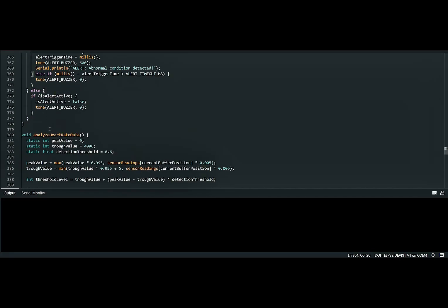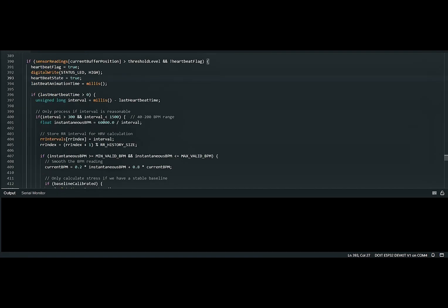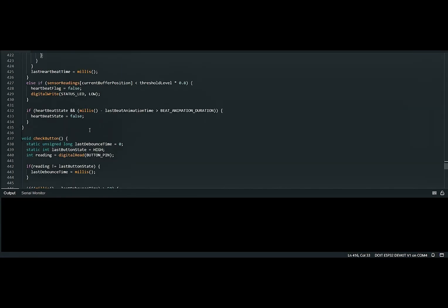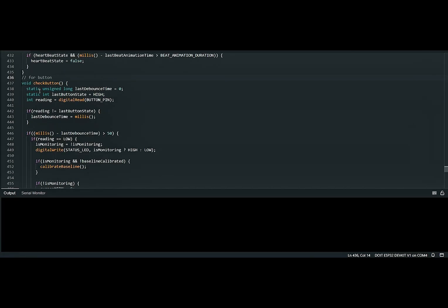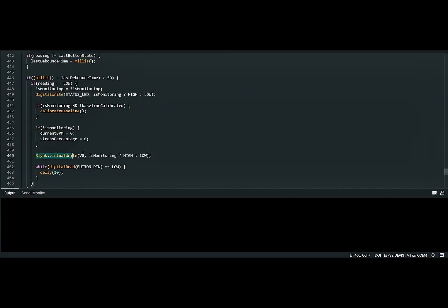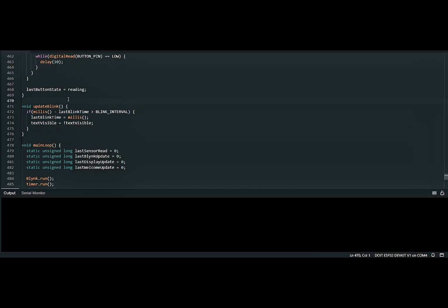So next part is void analyze heart rate data. So it will analyze the heartbeat state for the BPM, with variable states in detail for the BPM. So next is void check button. It will check the button state that may be high or low. So we will use it for Blynk too. Next part is void update blink. It is the update of the blinking text on the OLED display.